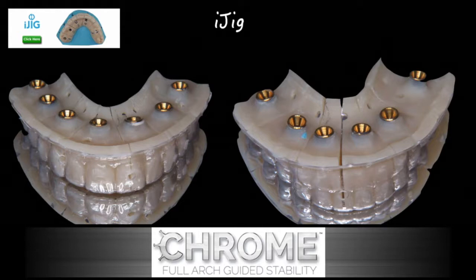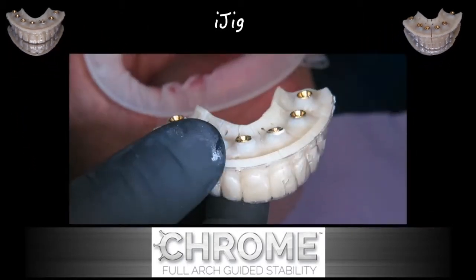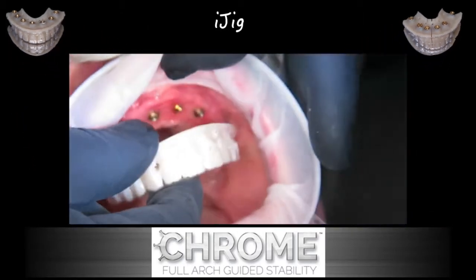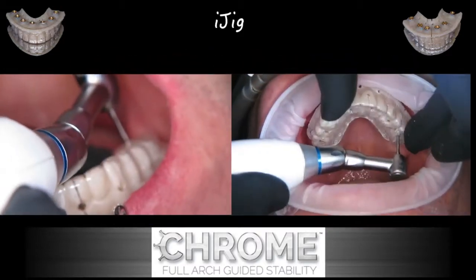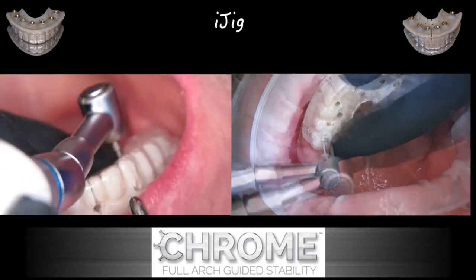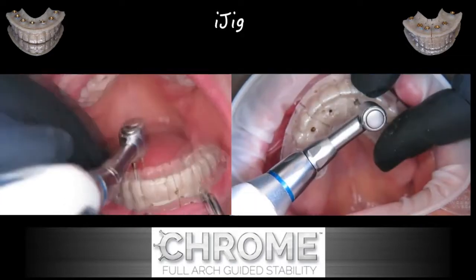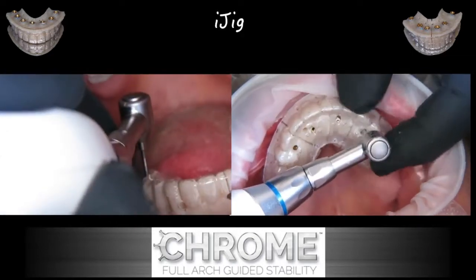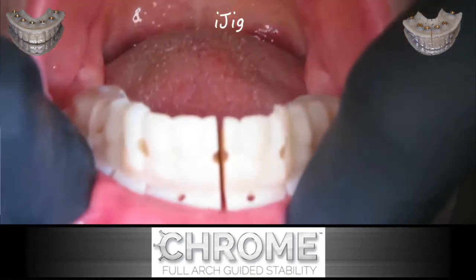Here's the iJIG. As you can see, there's a vacuform matrix over the top with the multi-unit abutment copings in place, and the iJIG itself is sectioned because we want to ensure a passive fit when the prosthesis is delivered to the mouth. We want to be able to transfer the position of the implants — as picked up in the mouth — to the laboratory, so there can be no mistake about the fit.